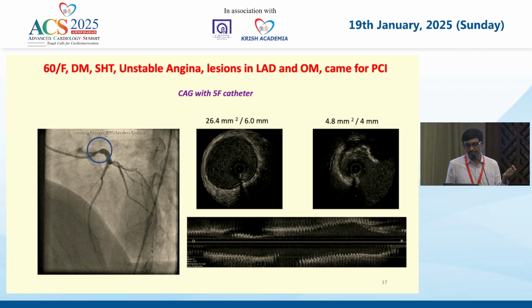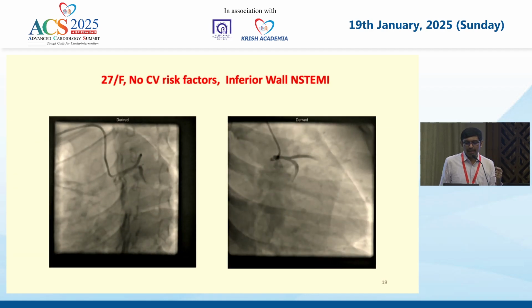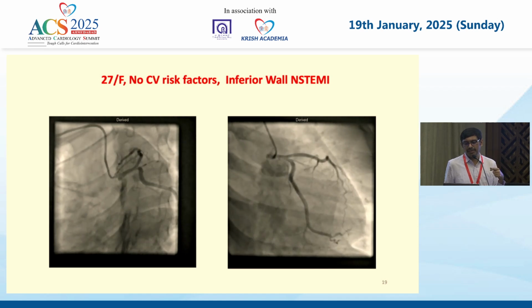Suppose you size based on your distal vessel, in this patient you might have produced an aortic root injury. So fortunately, this patient had additional lesions in LAD and LCX, and both were positive by FFR and went for surgery.